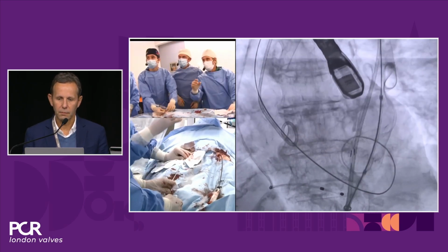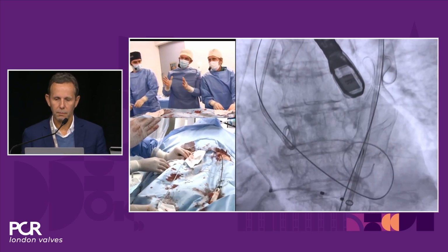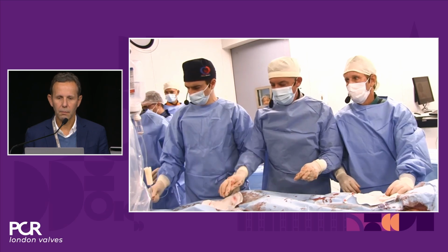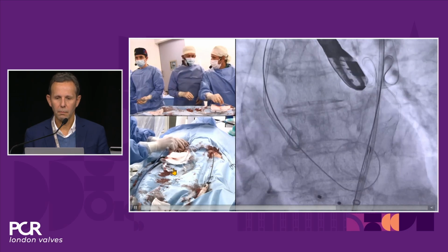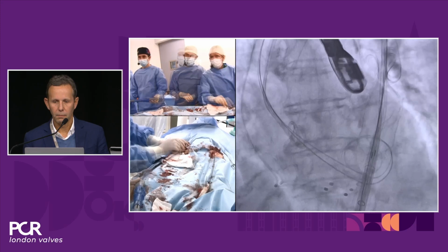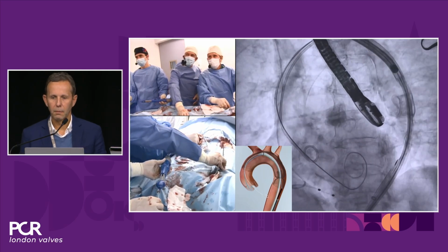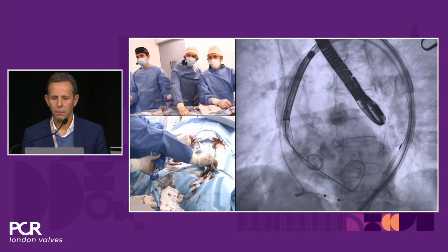Removing the balloon, also, again, no interaction with the Emboliner, passing the port very easily. Yeah, you can see that the port opens, dilates, and closes as we navigate with the different devices, but with no interaction, it remains in the same location. So now it's time to insert the 14 French 26 Evolut PRO+ that we chose for the case. So let's advance the valve inside the port. Beautiful. No interaction whatsoever to the ascending aorta.